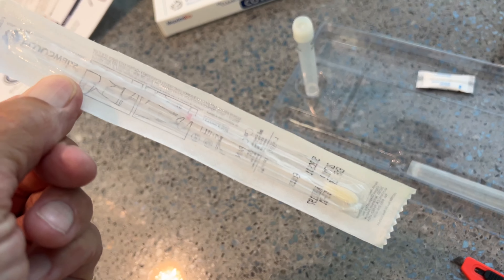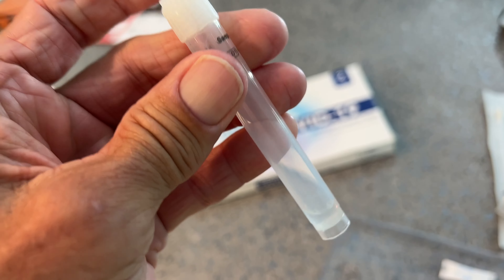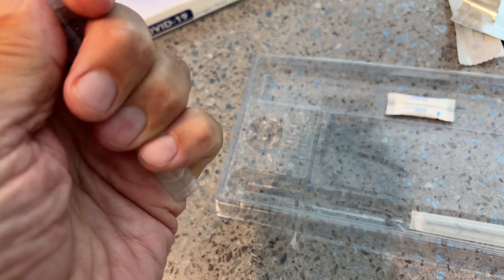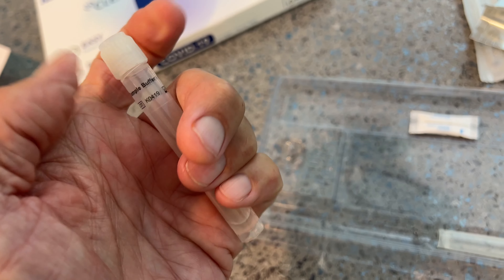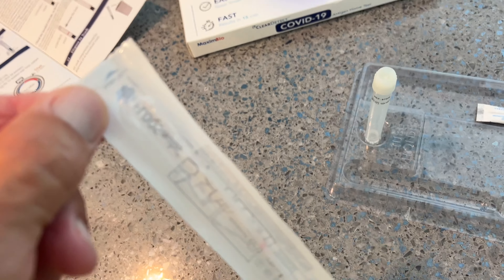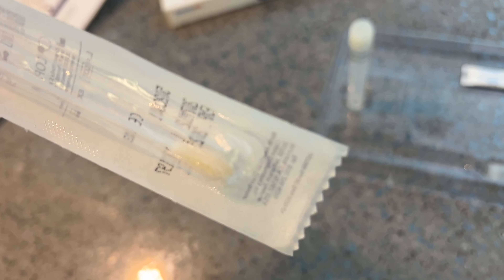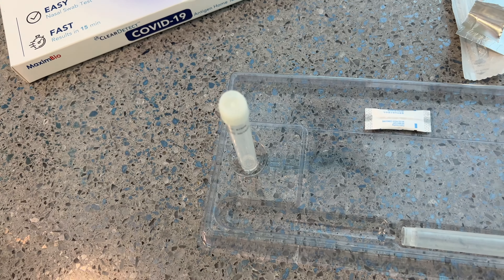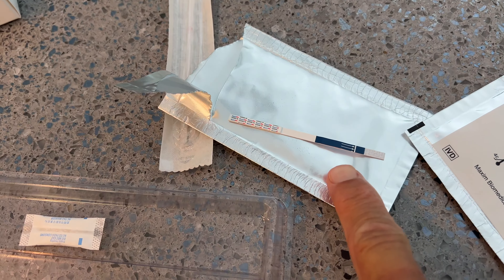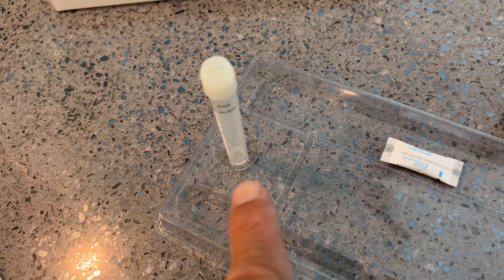So first we got to do the swabation. If you look, there's a little bit of fluid in here, and this is your holder, so you might want to loosen the cap so that you'll be ready to put your thing in, especially if you're using one hand. You got to pull open on this side — that's the swab at the other end — and then we're going to dip it in there once we do the nose swabbing, and this end right here is what goes inside.